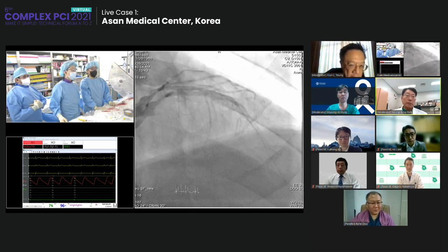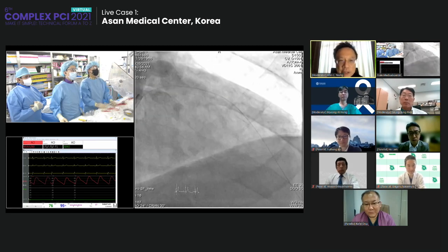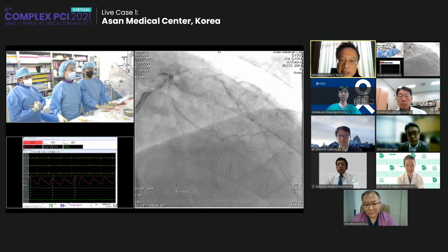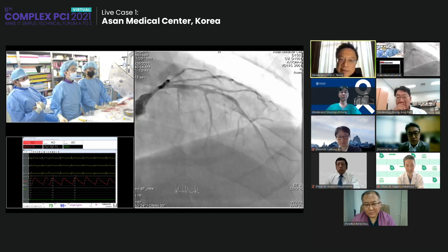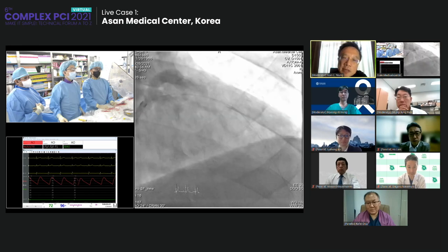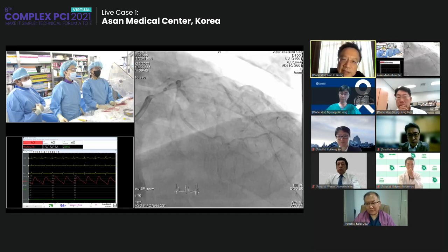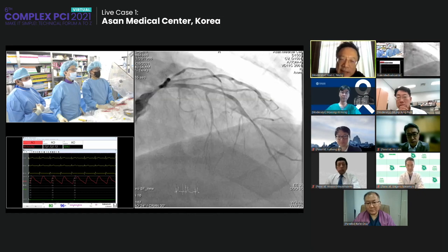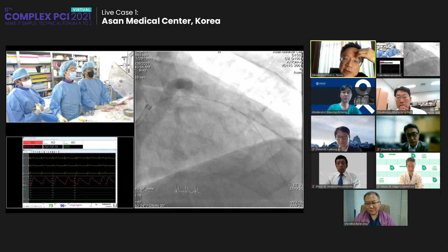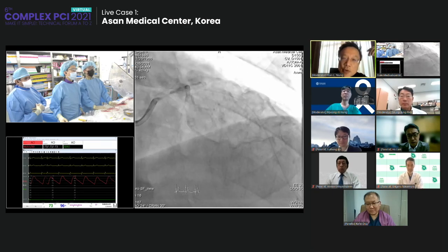Okay, all right, from the panel, Alan. Yeah, a lot of times we always think about PCI or surgery. I think this is a case that is actually PCI first, and then in the future, if for whatever reason he progressed, he could have bypass surgery, because you define the anatomy much better. And fixing that distal LAD matters because if you bypass the mid LAD, the distal is not revascularized, and a lot of the branches, potentially the diagonals, are not revascularized, because the left main is trapped on that side too. So PCI really helps define the anatomy and whether it is a total occlusion in the mid LAD. Fix that, fix the left main, fix what you can. If he's fine, great, but if he progresses in a year or two, he can still have bypass surgery.